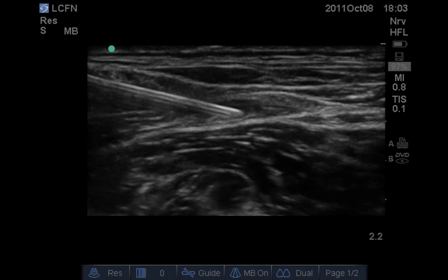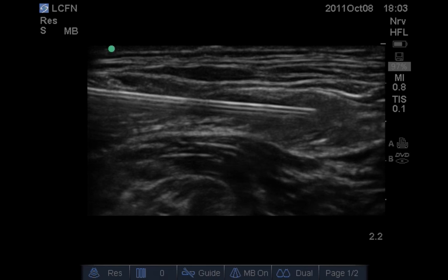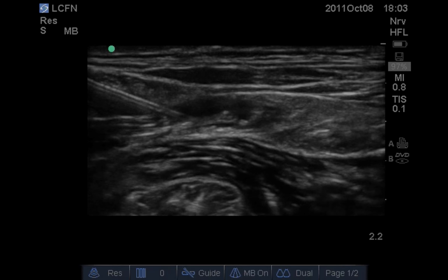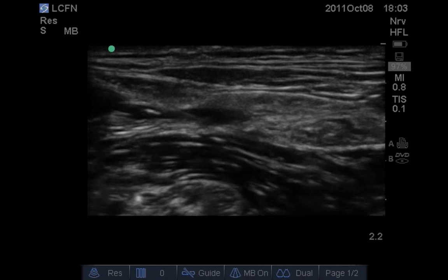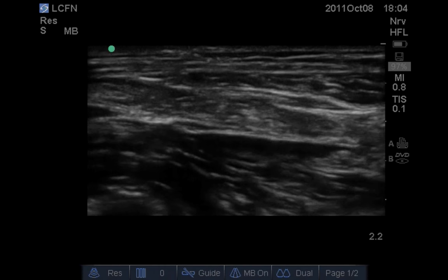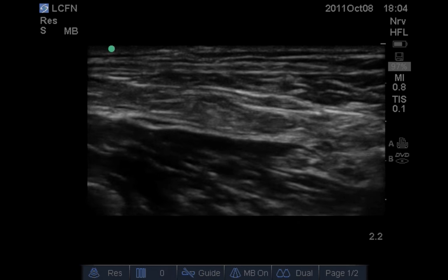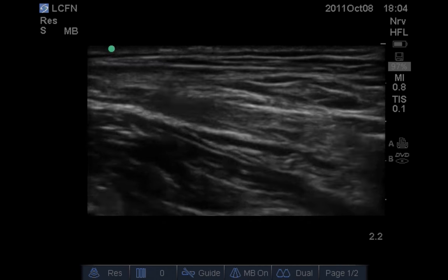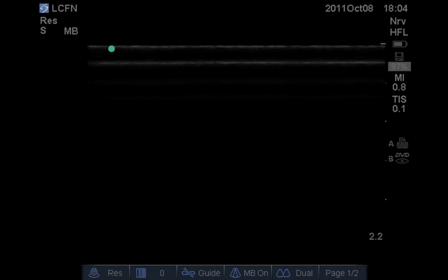Here we see the needle actually pierce the fascia lata, and we are depositing local anesthetic under the fascia lata — this will block the lateral cutaneous nerve. Then we increase the angle from the same point and pierce the fascia iliaca, depositing local anesthetic under the fascia iliaca. You can actually see the local anesthetic seeping toward the femoral nerve on the side, so you don't actually have to go and deposit local anesthetic directly onto the femoral nerve. This is a good technique for new learners who are concerned about causing nerve injuries or intraarterial injections, and we can use lesser volume if we want to reserve local anesthetic for other blocks.